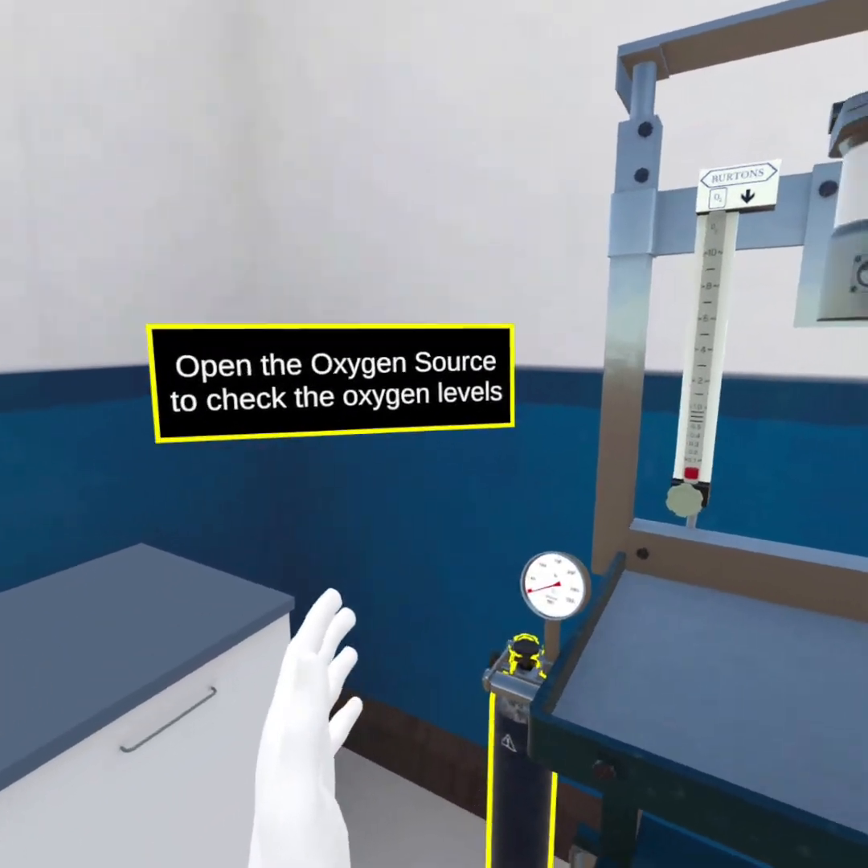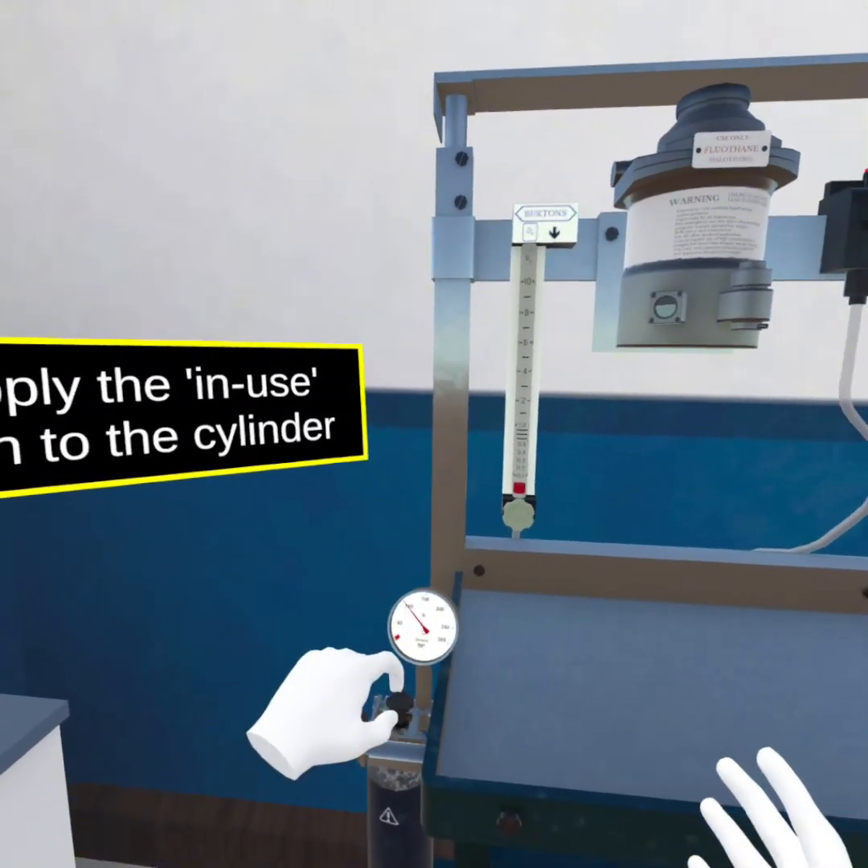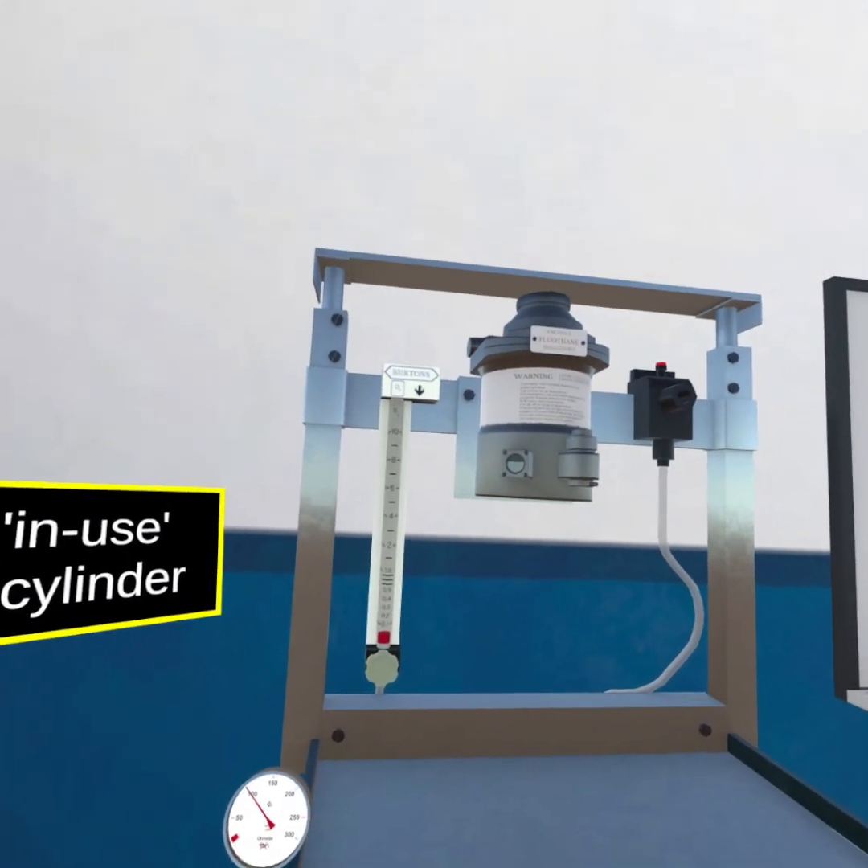Open the oxygen source to check the oxygen levels. Apply the in-use sign to the cylinder.